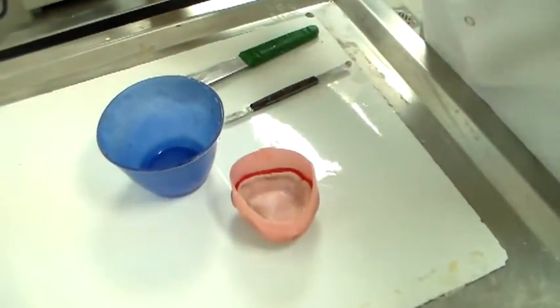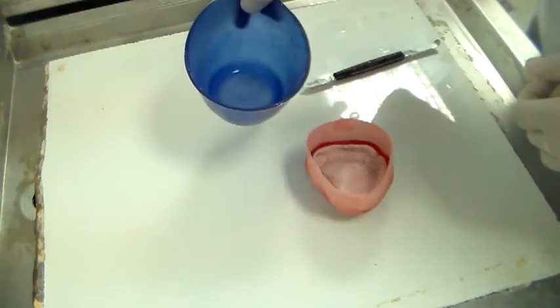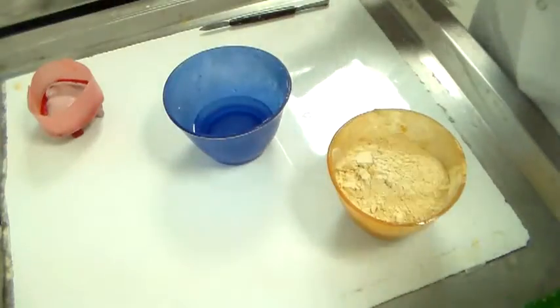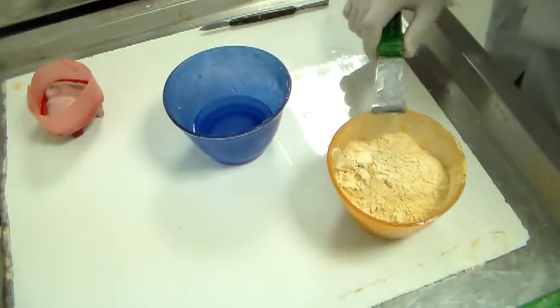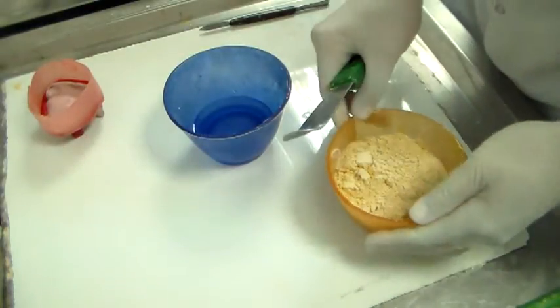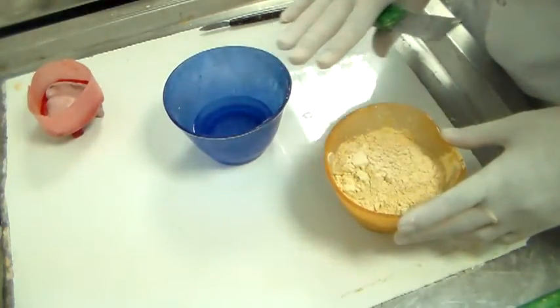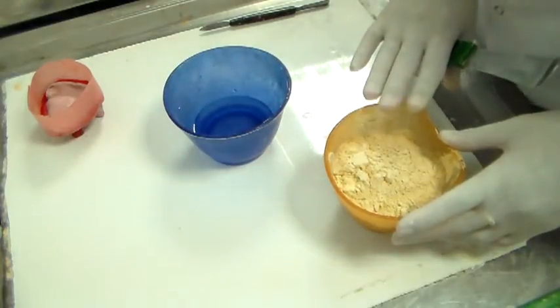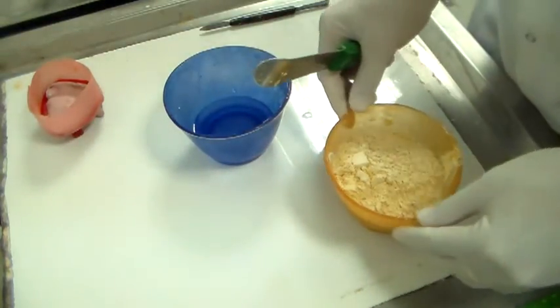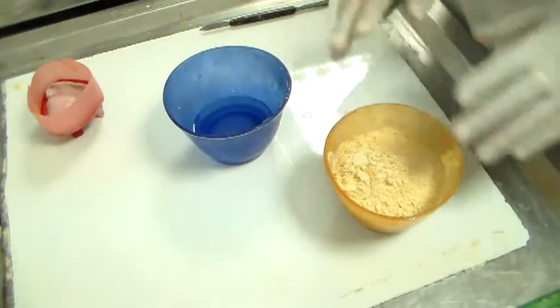We're going to work at this and you can see how the stone is going to be poured. Let me get some water and then sift some stone into the water. The powder is dental stone — this is type 3 dental stone. Dental stone, as you know, is alpha-hemihydrate, so the particles are crystalline, therefore you need less water to mix it. The water-to-powder ratio of dental stone is 28 to 32 ml per 100 grams of powder.